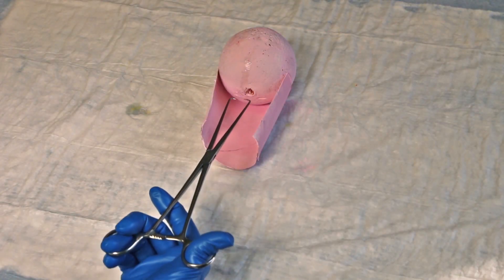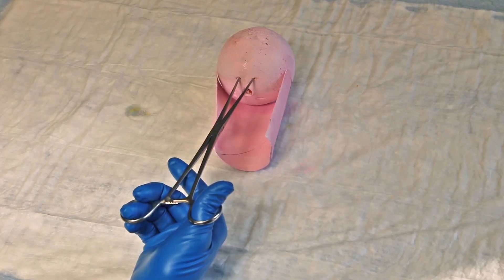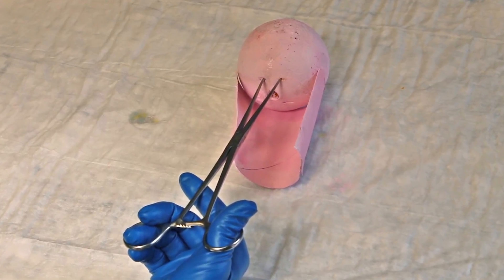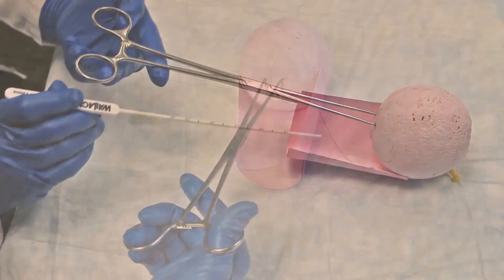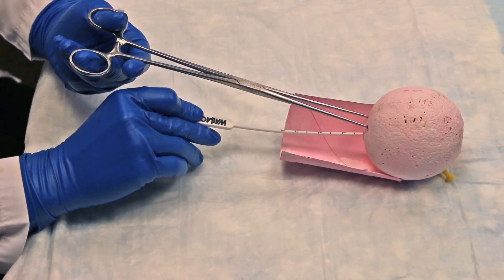Next, apply the tenaculum to the cervix at the 12 o'clock position. Use the tenaculum to gently apply traction to align the cervical canal and uterine cavity. Then insert the uterine sound to measure the depth of the fundus.